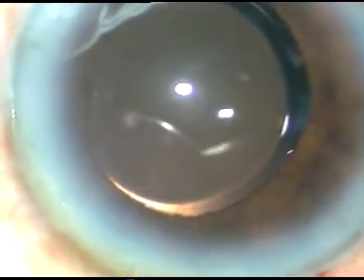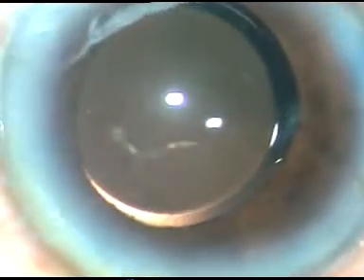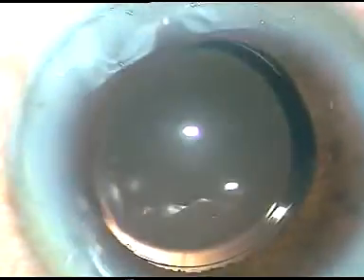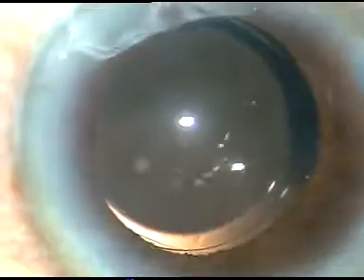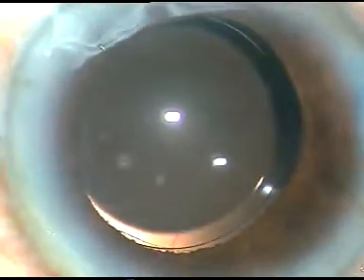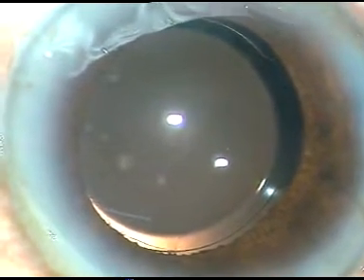A bit of moxifloxacin is administered. The sideports are hydrated to make these wounds waterproof. I always give a final wash — you can see that the viscoelastic sticking to the endothelium is removed. The visco that was sticking to the corneal endothelium came out.